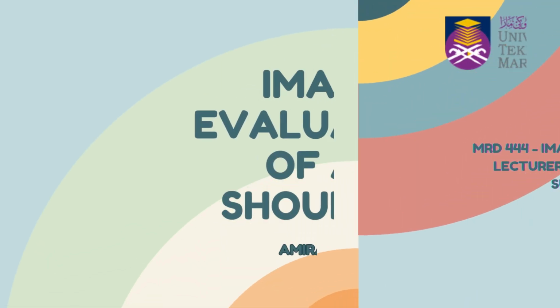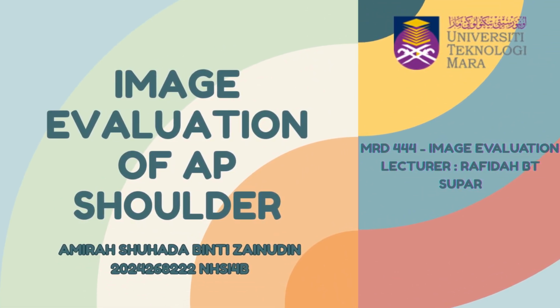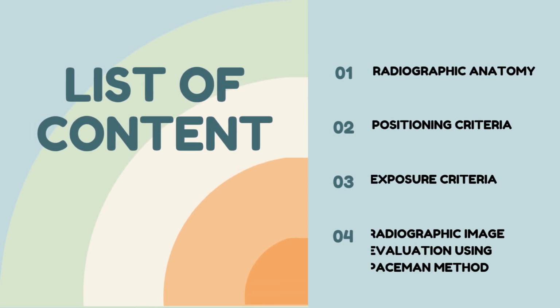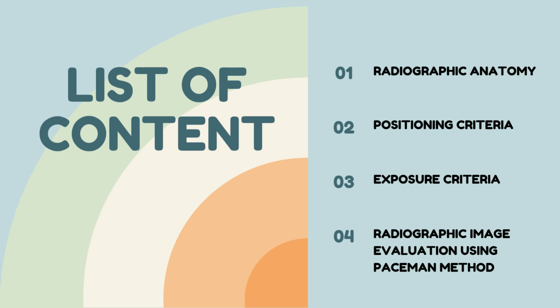This presentation is about image evaluation of A.P. shoulder. I am Amirah Shuhada from class NHSI4B and will present to you about this topic related to the subject M.R.D444 image evaluation. The list of contents for this presentation are radiographic anatomy, positioning criteria, exposure factor criteria, and radiographic image evaluation using the PACEMAN method.